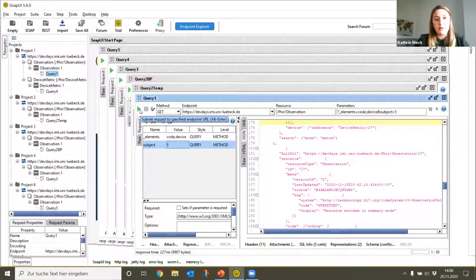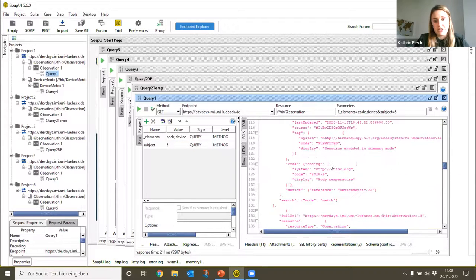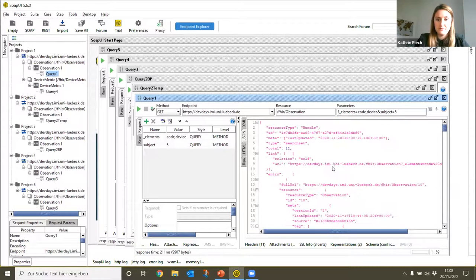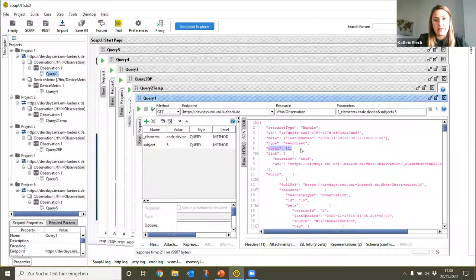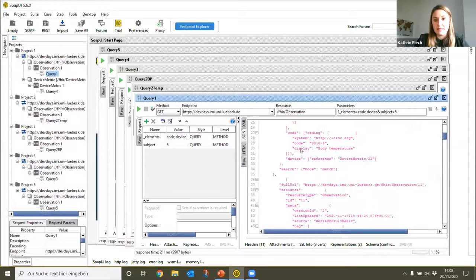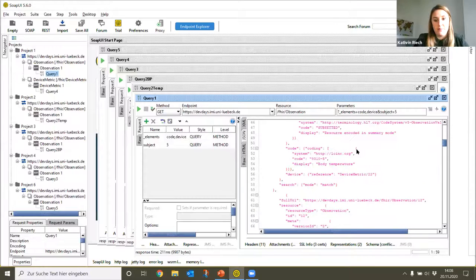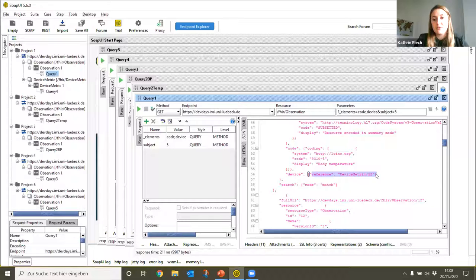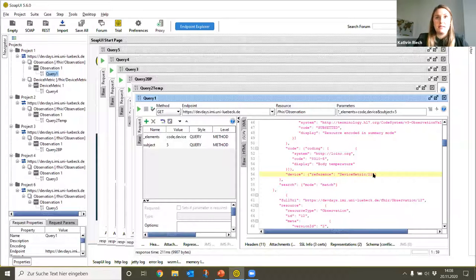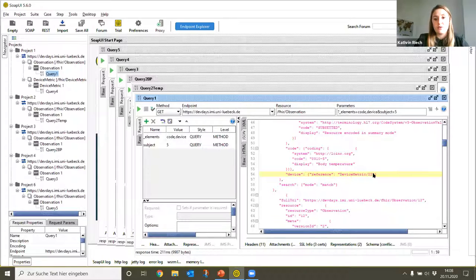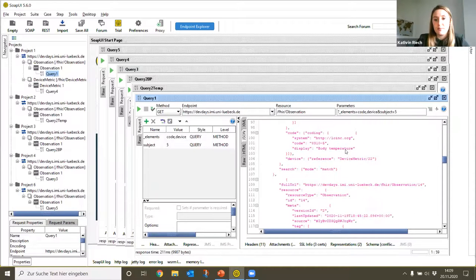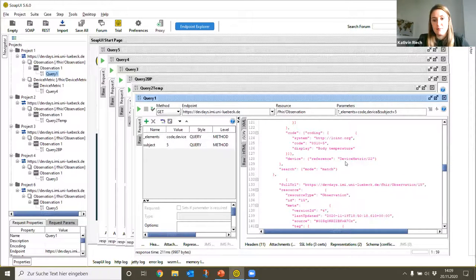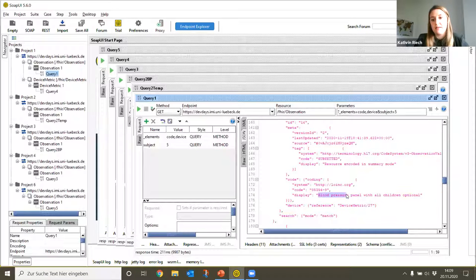With the green arrow we can start our query and the output is shown in JSON. You can see here that in total 12 resources that match our specifications could be found. We can see here that there are several body temperature measurements which have a reference to a DeviceMetric resource with the ID 22. If we want to know which device is connected to our patient, we need to search for the source or the parent reference from the DeviceMetric resource with ID 22. Besides the body temperature measurements, there are as well some blood pressure measurements available for our patient Pauline.